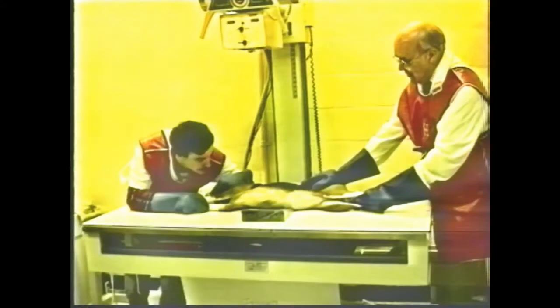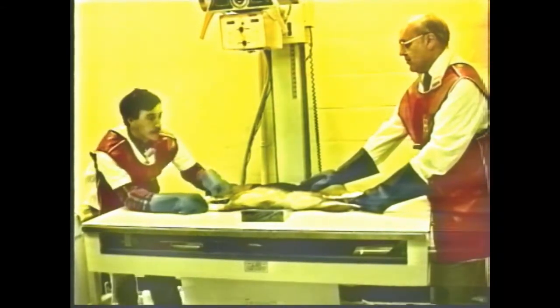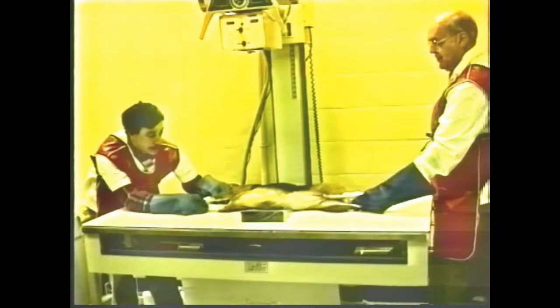When using manual restraint and the animal is struggling, the technician has a tendency to lean on the animal to obtain restraint of the patient. This usually moves the holder closer to or into the primary beam, which increases their exposure to radiation. When you find yourself in this maneuver, chemical restraint may be required to allow the holder to move to a safe distance. With manual restraint, the holder must attempt to stay as far away from the primary beam as possible.